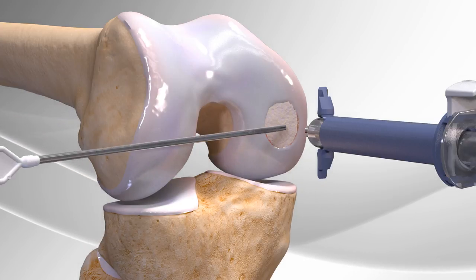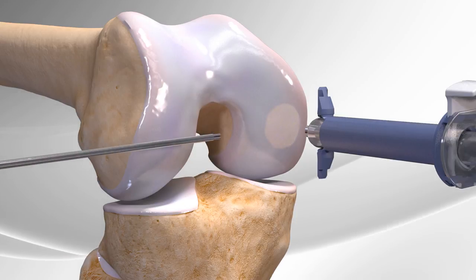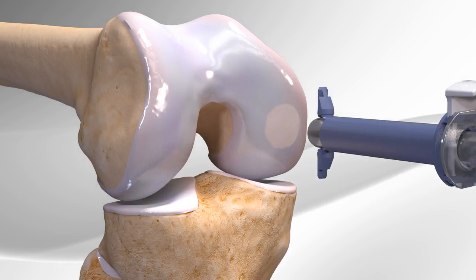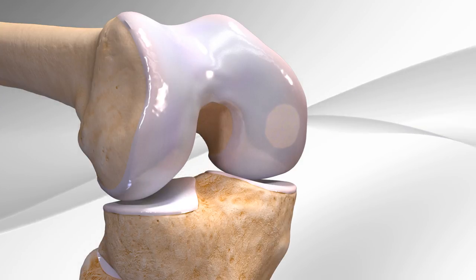Then a thin, light layer of natural fibrin glue is placed over the biocartilage to complete the procedure. Biocartilage may help to create new articular cartilage by promoting the best environment for healing.